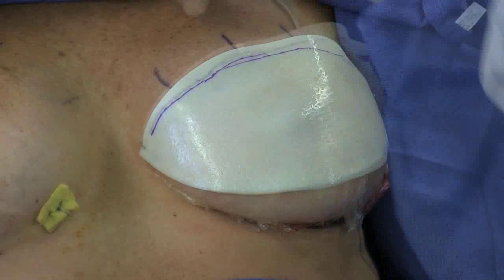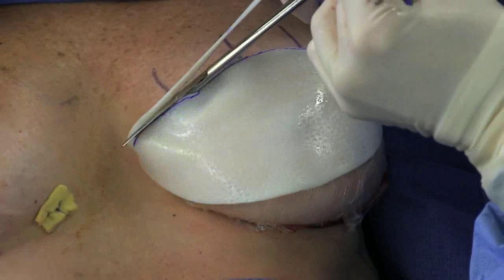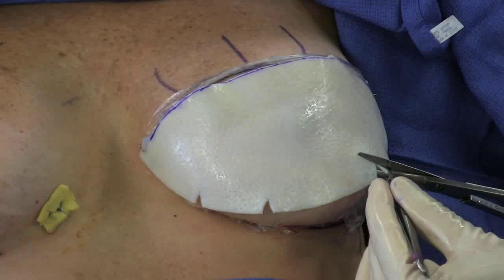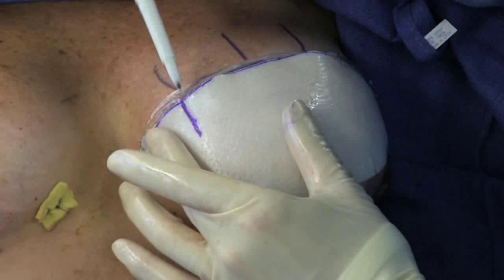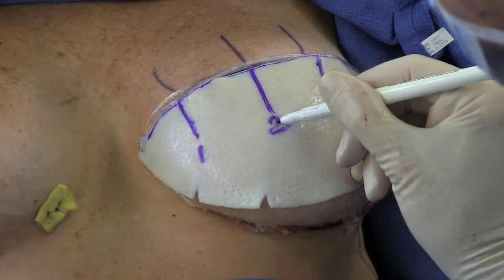Excess material is trimmed where necessary. Small darts are cut into the material so that it better conforms to the shape of the breast. The suture location marks are then transferred to the ADM. It can be helpful to number them to facilitate proper alignment when working inside the confines of the implant pocket later.